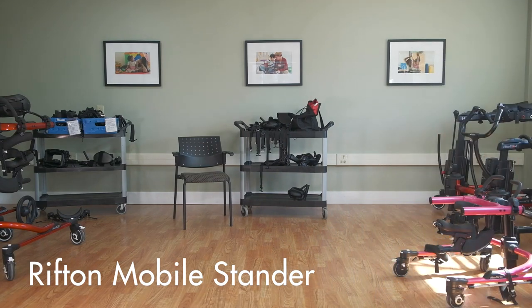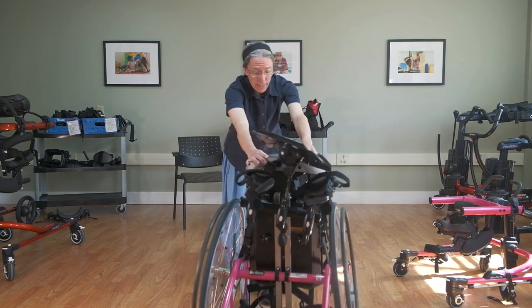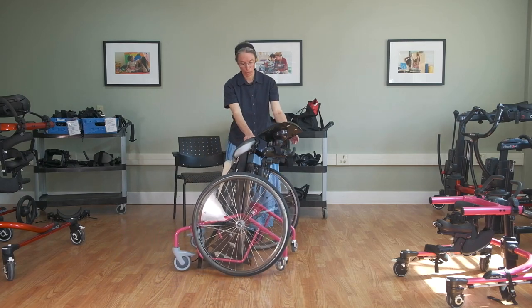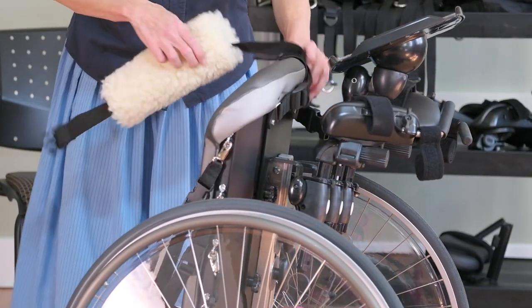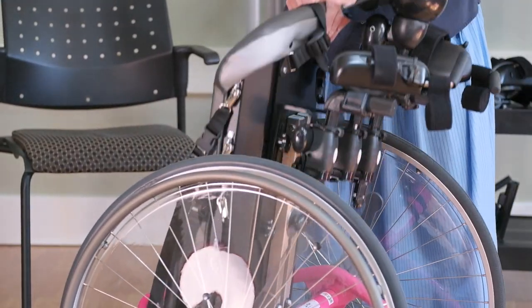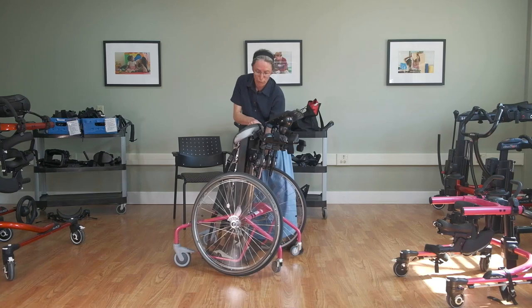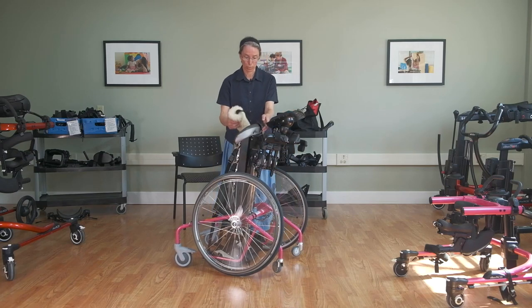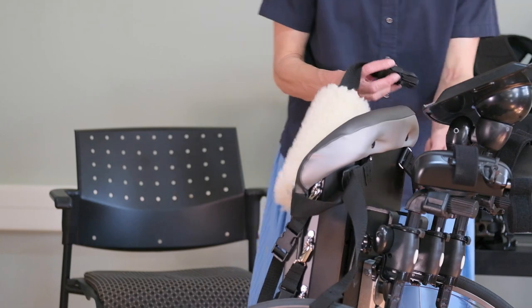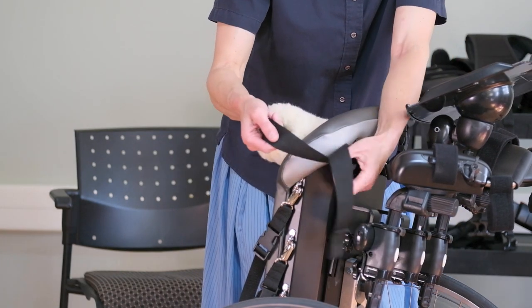The mobile stander comes in four sizes — a mini, small, medium, and large. It has a nice trunk board which can be raised and lowered to accommodate the student's growth, or to provide more support in the case of a lower-tone student, and then you would lower that support as their trunk control improved. There's a nice fleece that just buckles in place to go around the upper back or even the neck for a student who has severe hyperextension, to help hold their head forward.